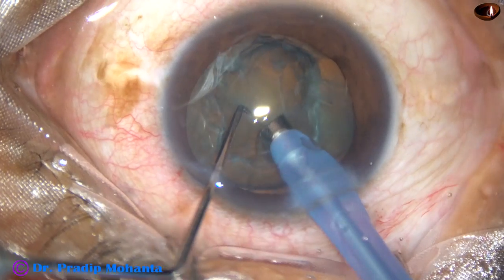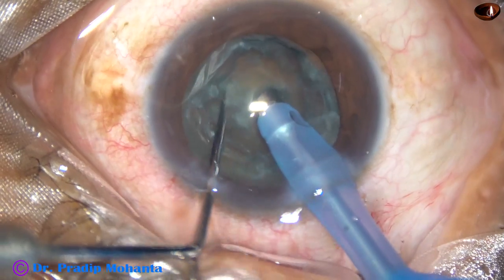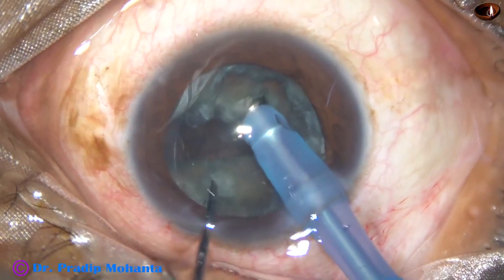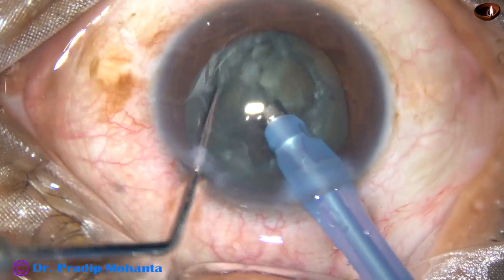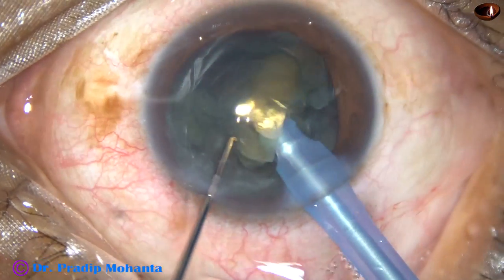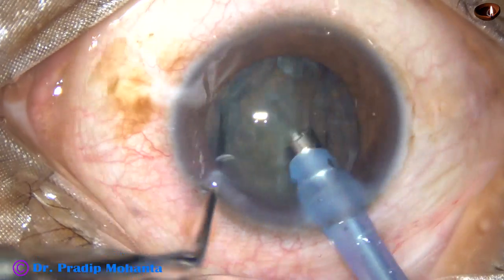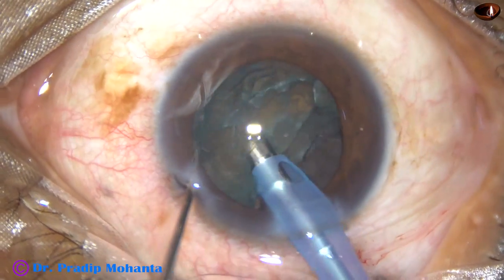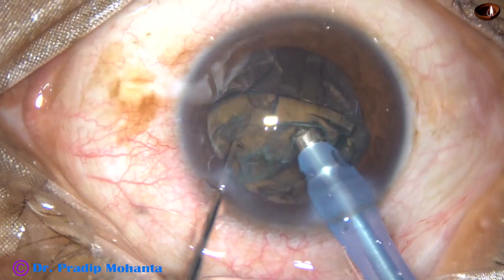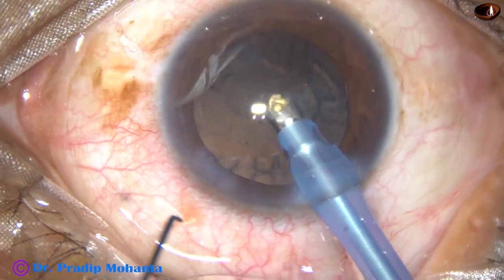I will support the lens mass with irrigation, then try to chop it — and I could do that. Now I am trying to separate the two hemi-nuclei completely. One hemi-nucleus tumbles and comes to the tip and is emulsified. Then I hold the other hemi-nucleus and emulsify it as well.